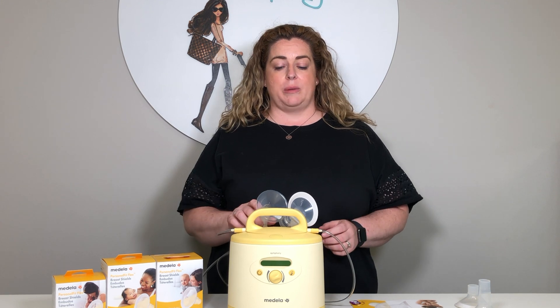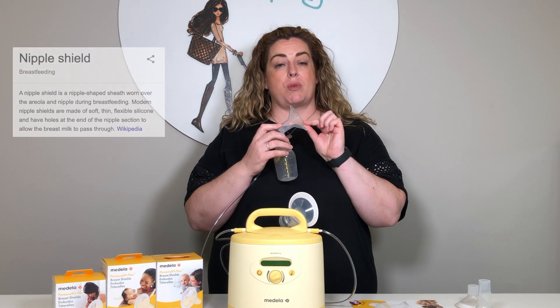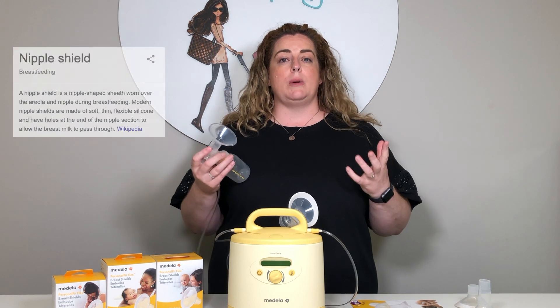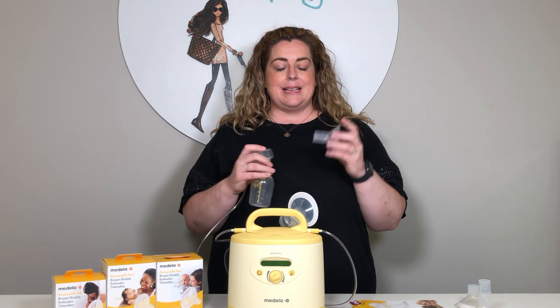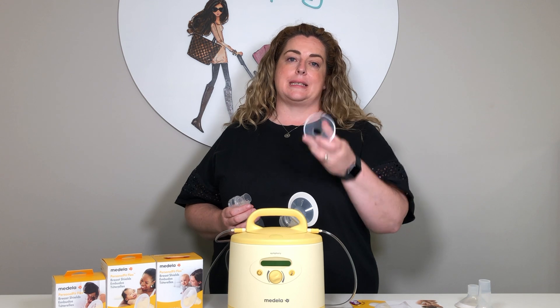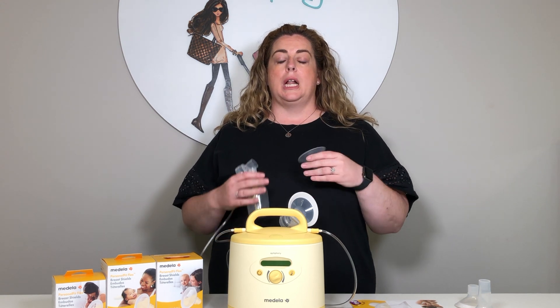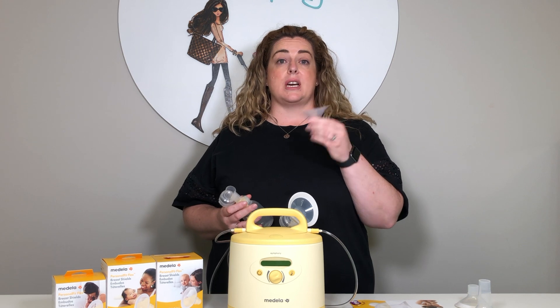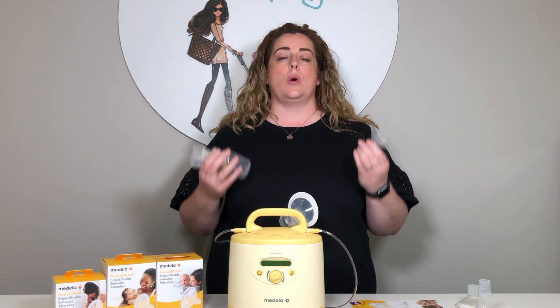So stick with us for today and we're going to be talking about these guys. These are breast shields — breast flanges — they can have a lot of different names, but what I really want to tell you about today is that they come in different sizes. Some people look at me as if I've got three heads when we talk about the fact that these come in different sizes, because they genuinely had no idea.